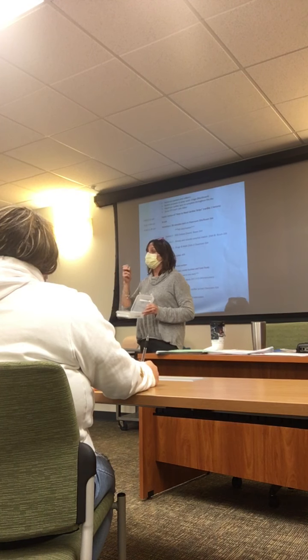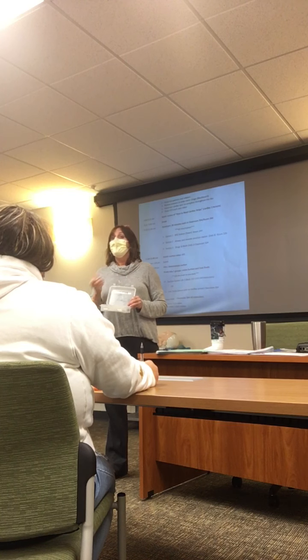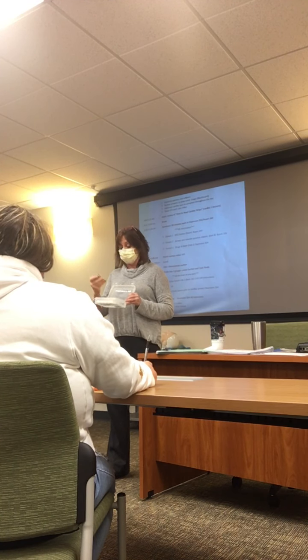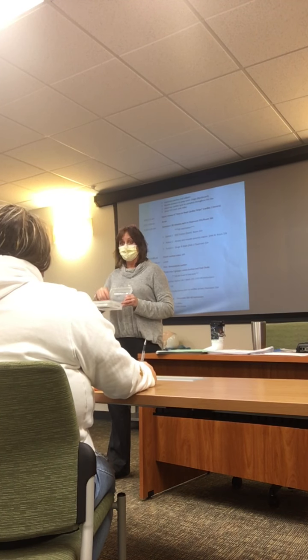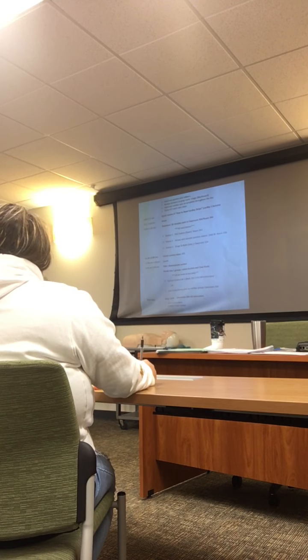Because I can actually go through all those layers, and then I can bleed out into the pericardial sac. So the two big things we worry about with implantable cardiac defibrillators or pacemakers are infection and cardiac tamponade. Okay? So I'll pass these around if you guys haven't gotten a chance to see those.